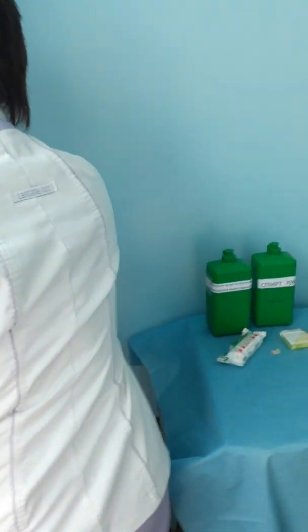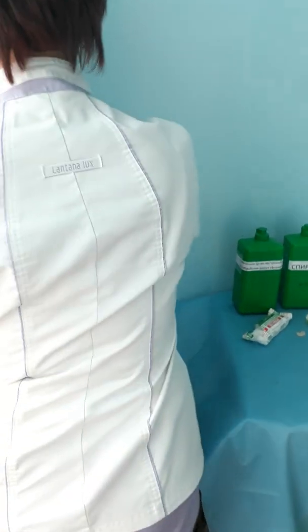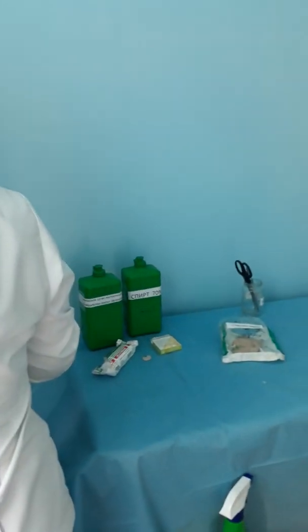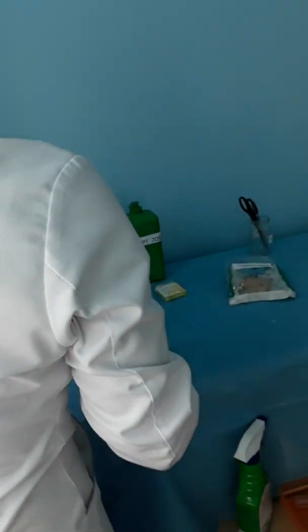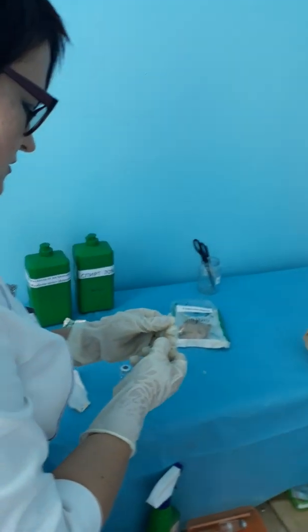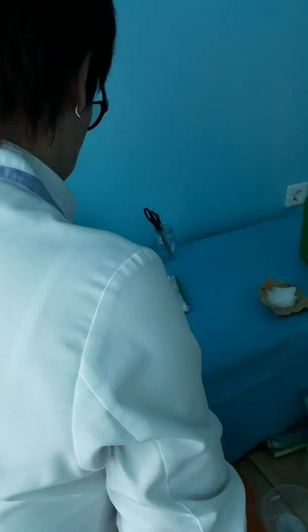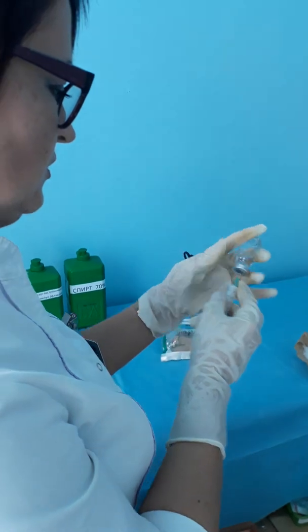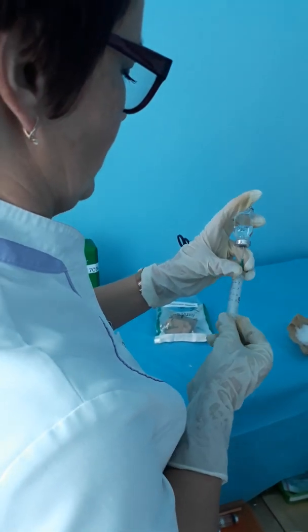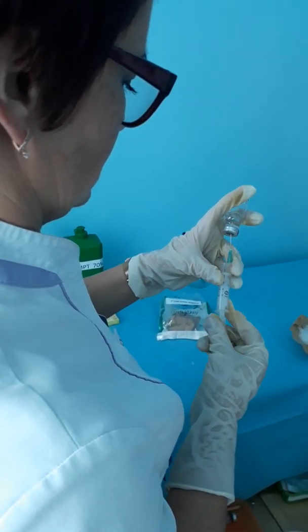You prepare a syringe like for intravenous injection. You check and prepare additional medicine. Which color needle, ma'am? Take from the vial with the green one. For administering solution, aspirate. You clean this vial too. Aspirate, like the solution.